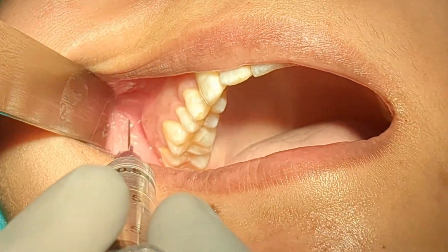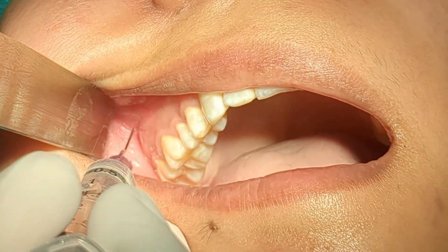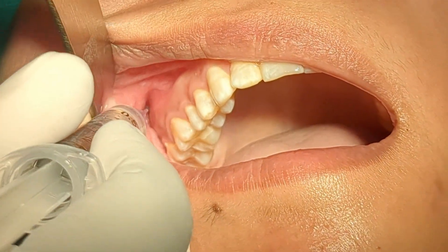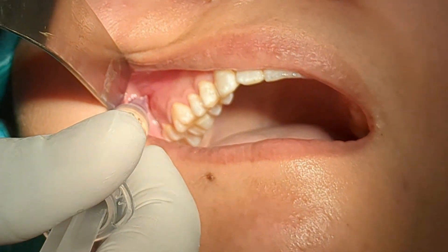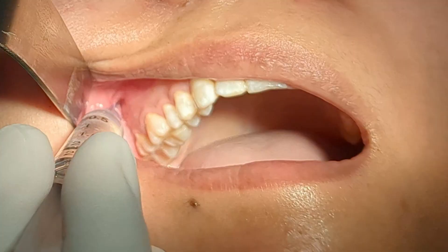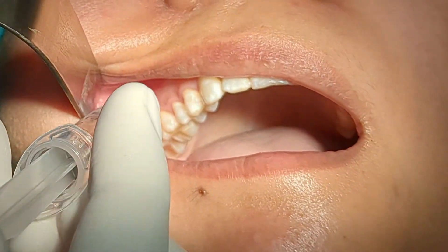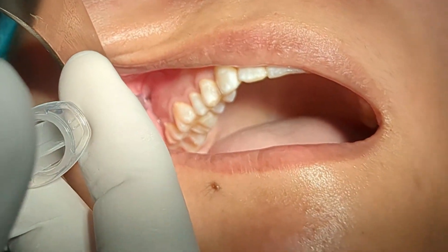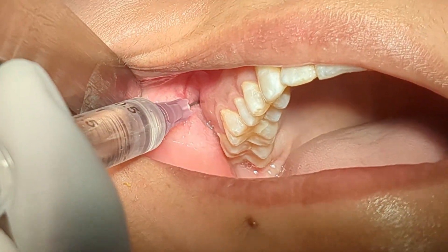Now I am inserting the needle at the site. Make sure that the needle of your syringe is at a 45 degree to the occlusal plane. Depth of needle insertion is 16 mm. Aspiration is negative. Deposit 1 to 1.5 ml LA solution slowly.